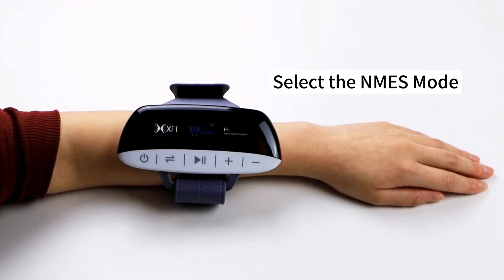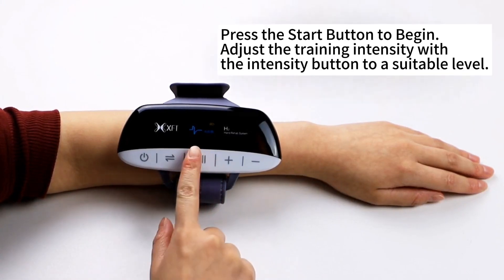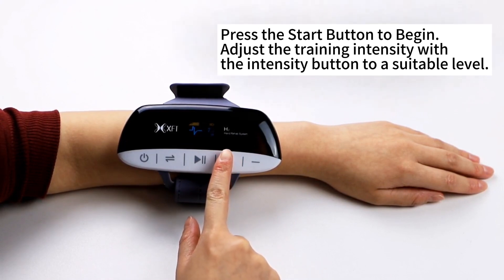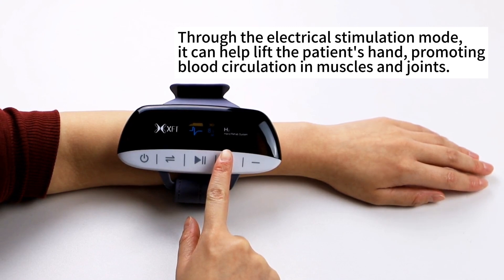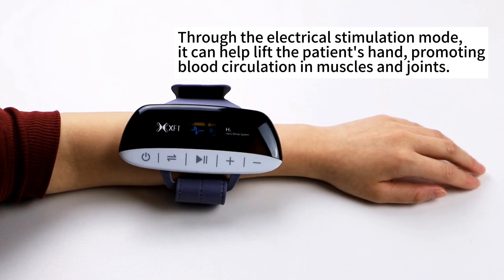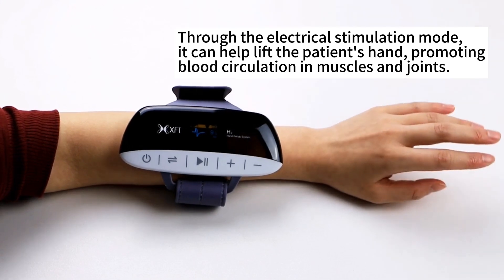Select the MS mode. Press the start button to begin. Adjust the training intensity with the intensity button to a suitable level. Through the electrical stimulation mode, it can help lift the patient's hand, promoting blood circulation in muscles and joints.